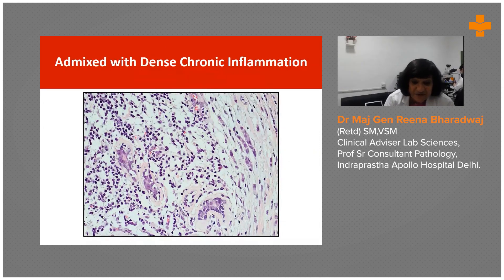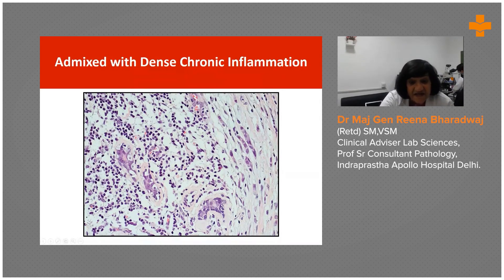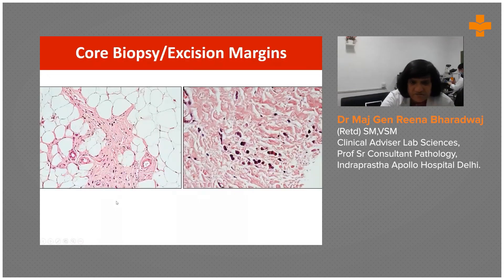Lobular carcinoma can be mixed with inflammation and can be so deceptive and surreptitious that you will not notice them. At the periphery is the lymphoid infiltrate, and the cords of lobular carcinoma hide in between. This is especially important on core or excision biopsy, where large pleomorphic cells can be easily missed if you don't concentrate.